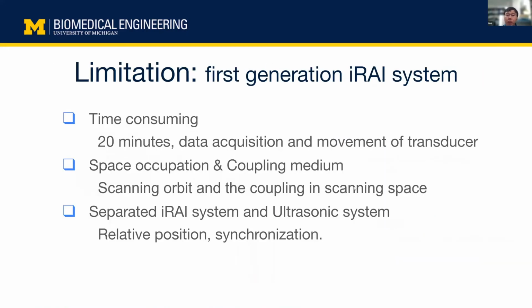But as you know, the first generation iRAI system has several limitations, such as time consumption. It takes around 20 minutes or even more for the data acquisition and the movement of the transducer. It also needs a very large space, and the coupling media need to occupy the whole space, which makes it really difficult to perform experiments.